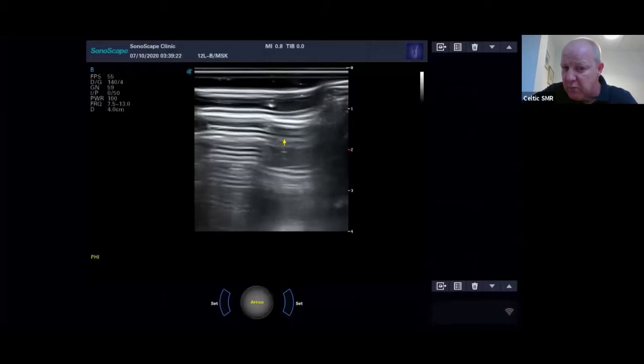It's not one that I've done. You'll end up in the same place probably, whether you come laterally or medially. But I just find it easier to scan medial to come, because you're facing the right way. Whereas if you come laterally, you're going to have to come across and then angle back, because of the way it's positioned. So it's probably just easier to come medial and angle straight across. You're facing the right way coming across.